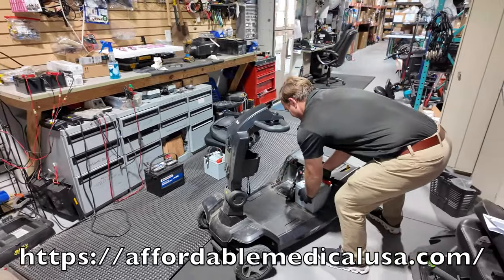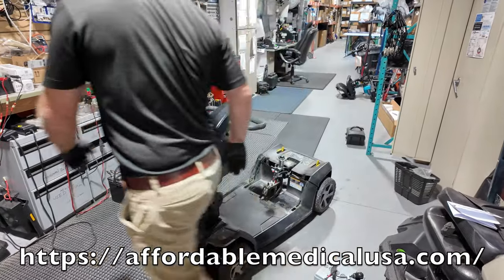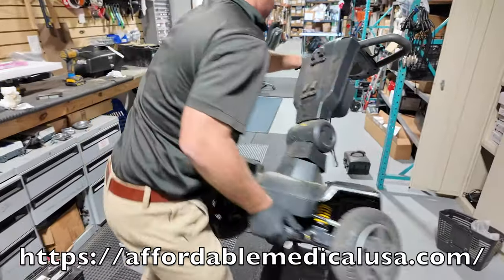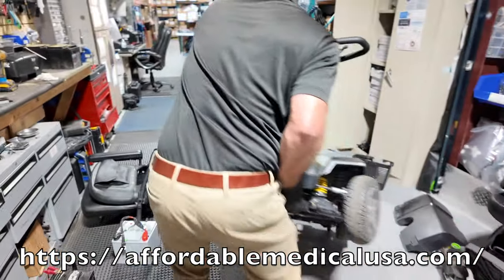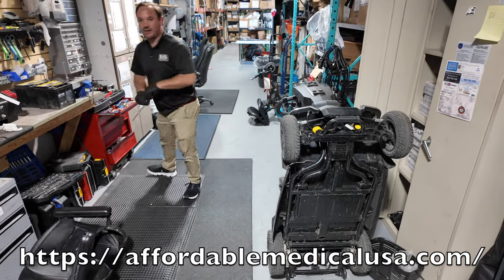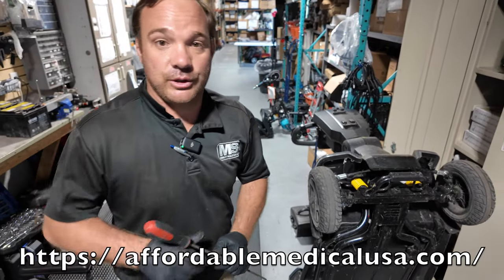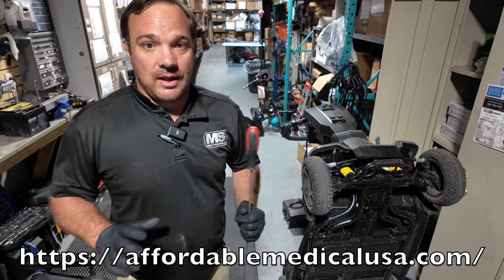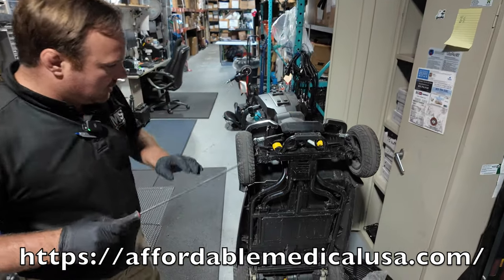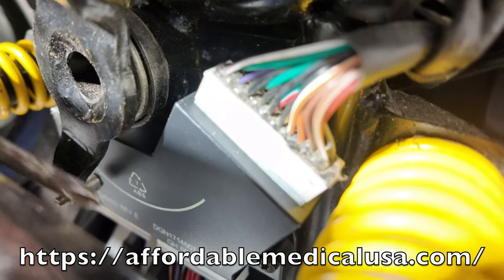I've already done the repair, so I'm not going to walk you through all of it, but I'm going to pick the front end up and lean it back on those anti-tippers. This is really important — if you have this scooter, this is probably going to happen to you, or it already has. If you take it to a local dealer, they might not be able to figure out what's wrong and will charge you a ton of money unless it's under warranty.